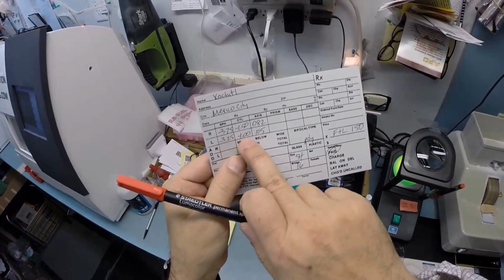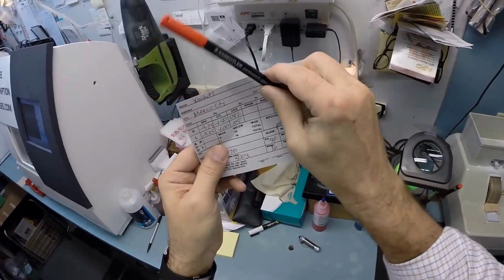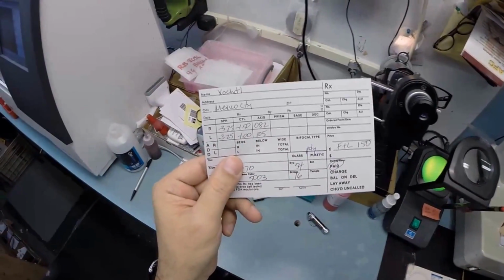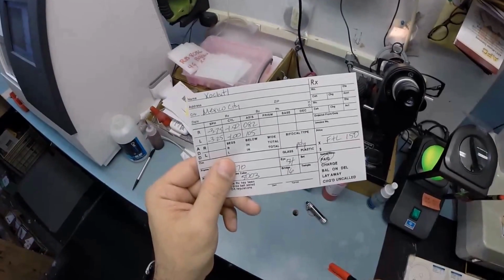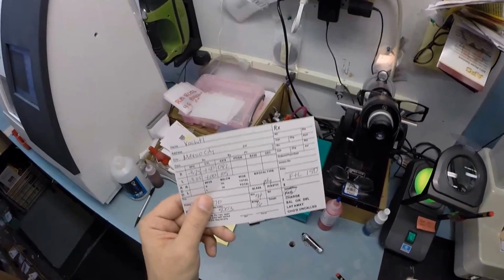So your combined total powers are 4 1/4. But we're going to turn that knob past 90 to 105. Now these first 2 numbers are real values that we should be concerned with. This last number could be your axis as it is. It can be anywhere from 0 to 180.